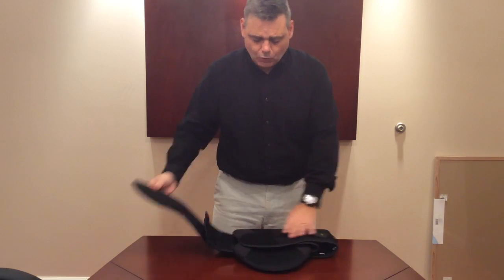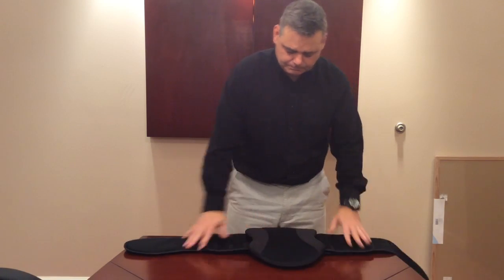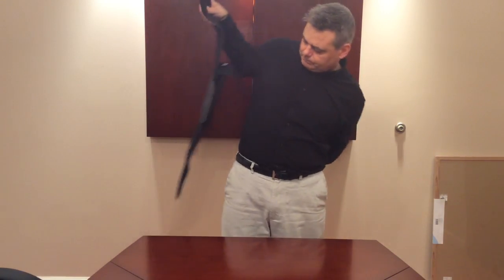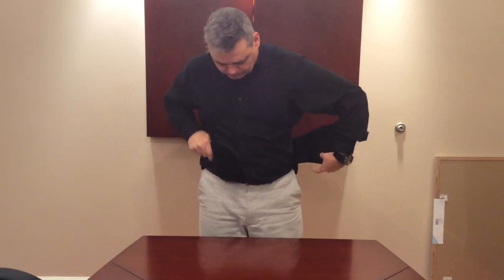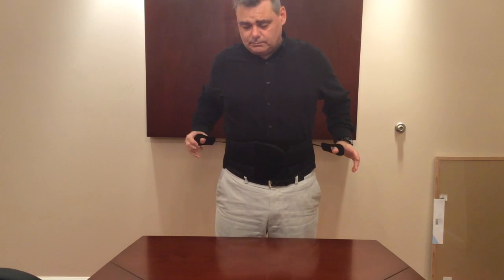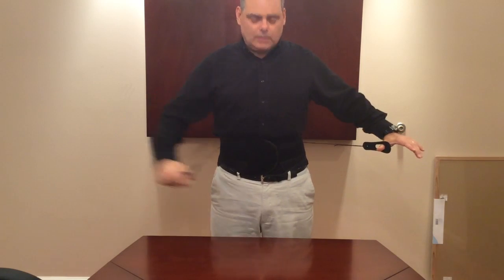Lay it flat on the table, open it up, stretch it out. Take the brace, put the right panel over the left panel, right above your hips, and use the thumb loops — there's one on each side. Pull the thumb loops out and then across your body and then Velcro back onto the belt.